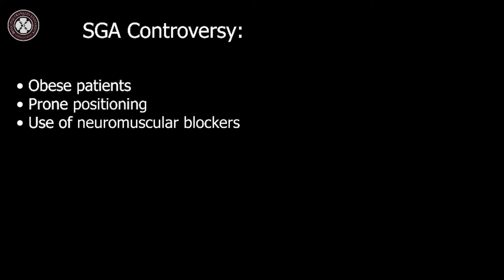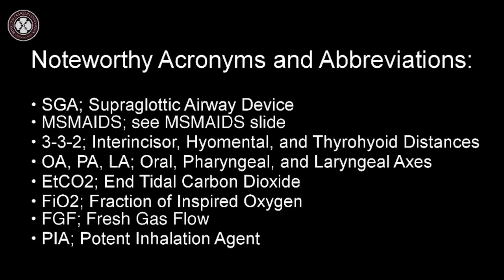There is some controversy surrounding SGA use in various patient subsets. For instance, in morbidly obese patients, and those who will be positioned prone, or if the use of neuromuscular blockers is anticipated. Without clear guidelines, use of an SGA for these patients is considered acceptable at some facilities and not others, so it's best to follow your hospital policy. This screen shows acronyms and abbreviations that will be used throughout this video.